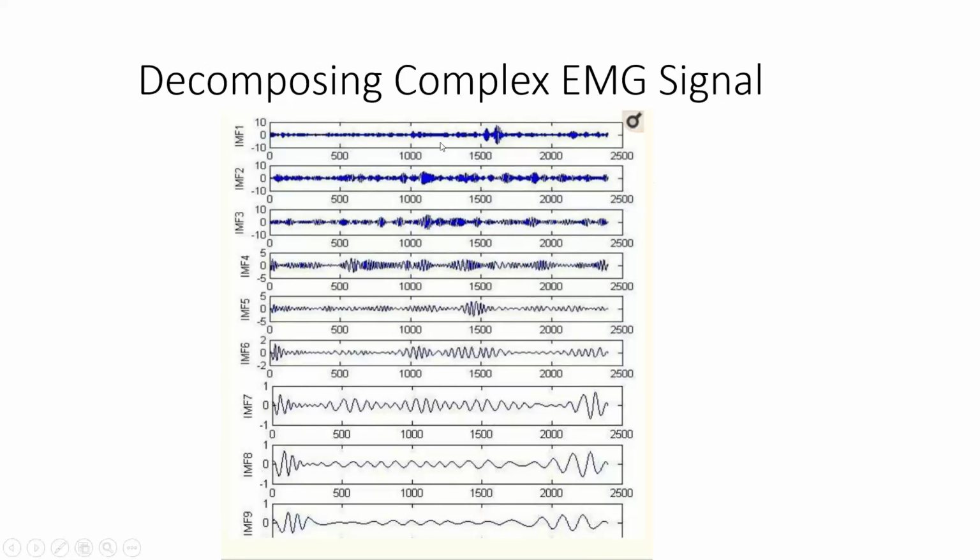These authors took that signal and progressively decomposed it so you can see the different components that are in here. So you've got a lot of different motor units contributing different components depending on where you place the sensor and how much of an area they're gathering in. Your EEG sensors are gathering information from a pretty big area on the scalp. That's bringing in a lot of millivolt level energy, and you're trying to collect microvolts.